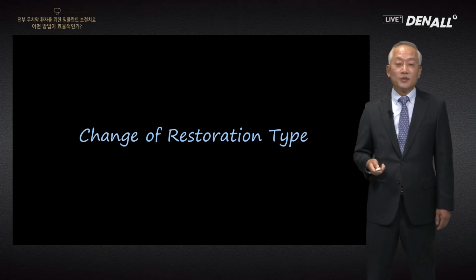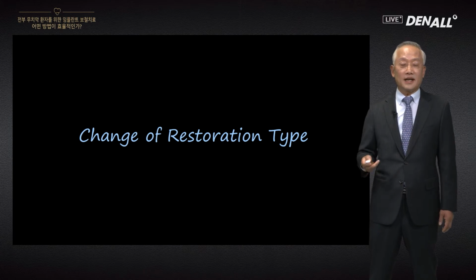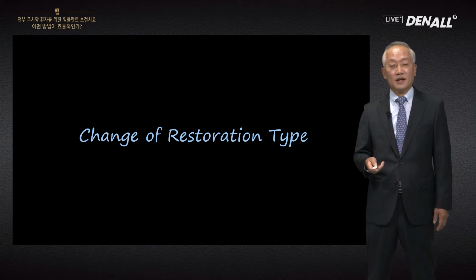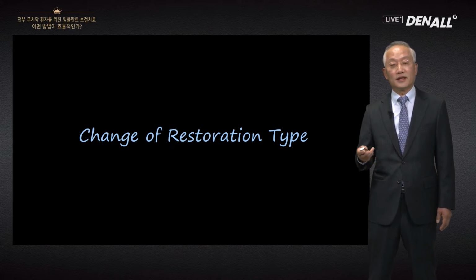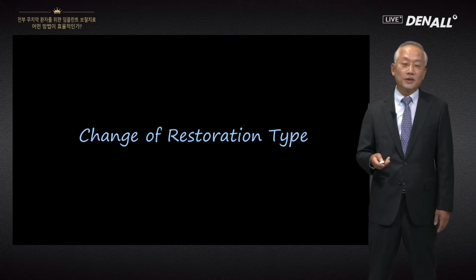When we look at these results, in terms of patient satisfaction, fixed is slightly better than removable, but there's no major difference. Let's look at the changes in restoration type, looking at clinical cases.